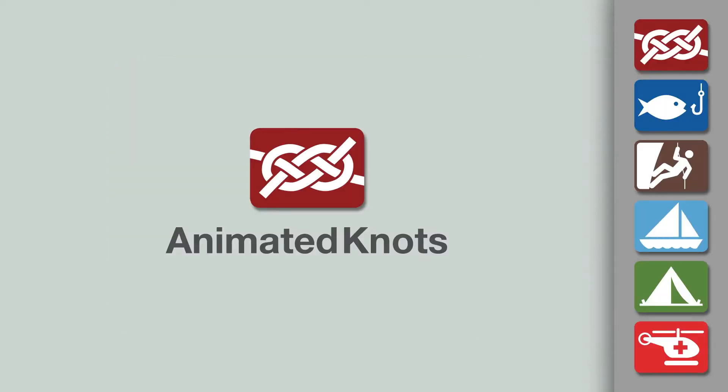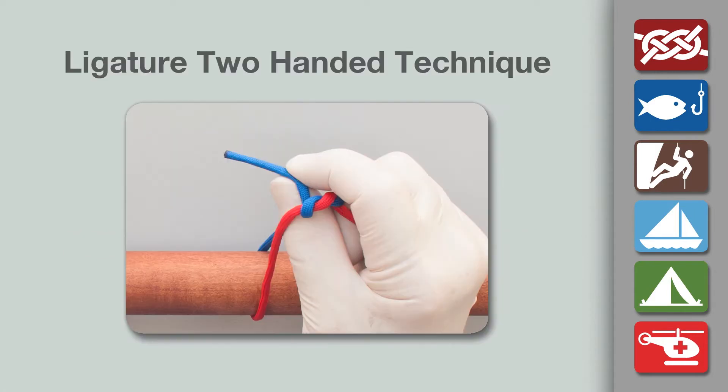Welcome to another knot tying demonstration from animatedknots.com. This video teaches you how to tie a surgical ligature using the two-handed technique.